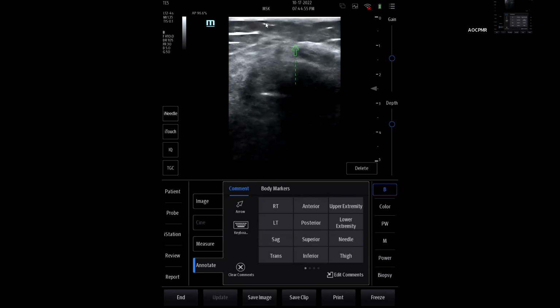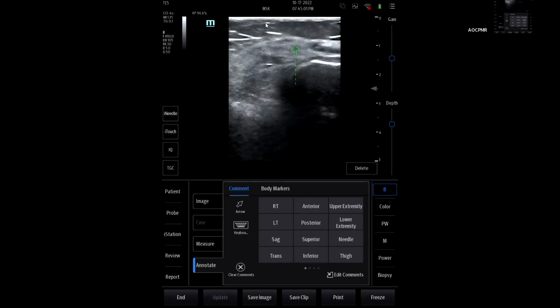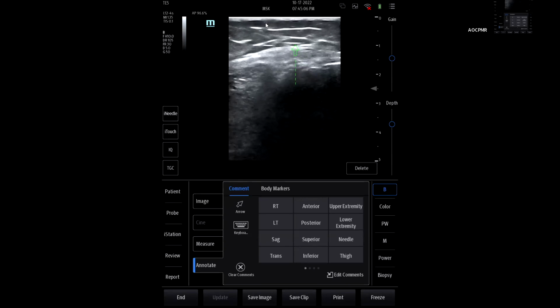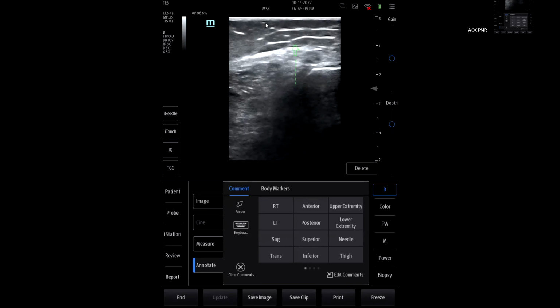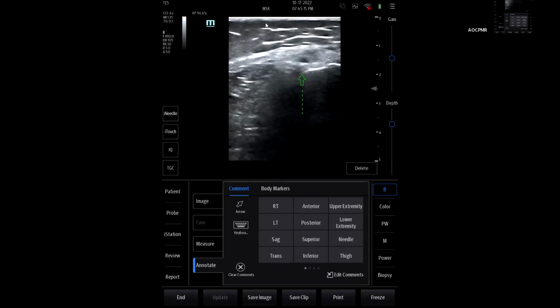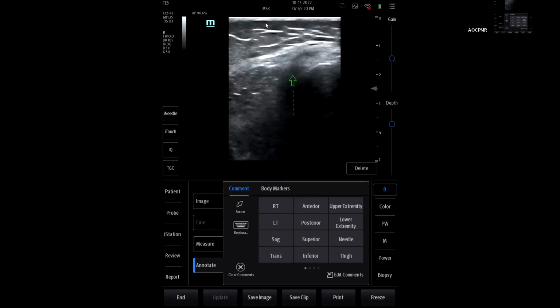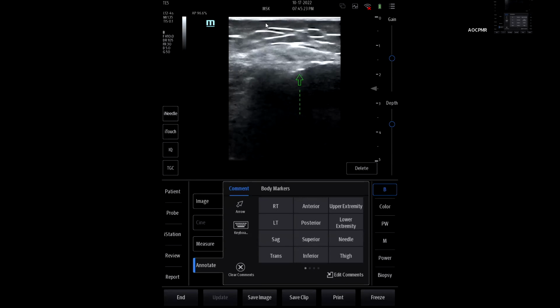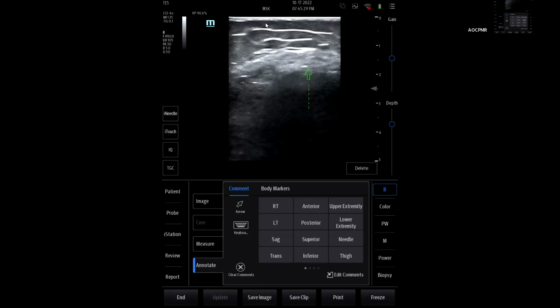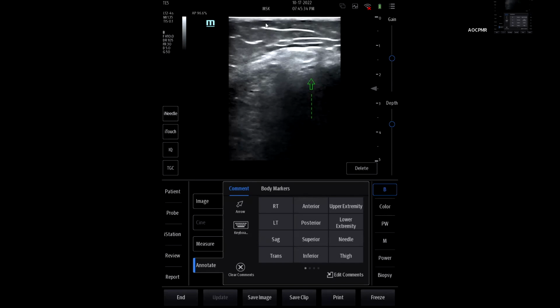And then posterolateral evaluation, looking at the fibular head. It's difficult to find that common peroneal nerve, but you can find it. For her, it's right here. It's this thing. It spirals around pretty quickly. So as I move superior, inferior, you really have to tilt the probe to get a good picture of it. Here it is. And you can see it, as I move a little bit superiorly, it's wrapping right around that head, wrapping right here.